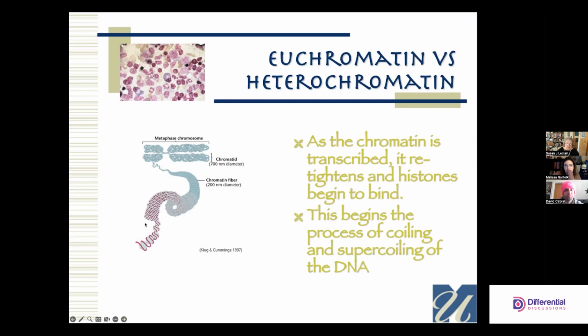So no hemoglobin, a little bit of hemoglobin. I got it. I know what I'm doing. I can drive by myself. Oops, that's an accident. And then I'm an adult, you know? There's that movement. And if you think of these cells as being alive and reacting to what's going on, then all of a sudden it makes such great sense that these cells would do this.